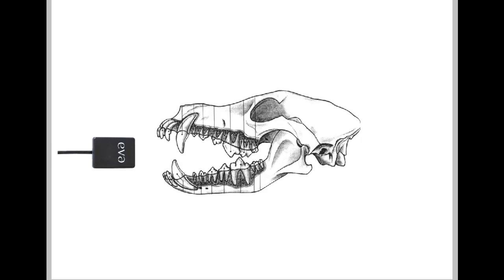And then again, going for the maxillary, we would face it in portrait with the image side up if we're going for the upper teeth, or the image side facing down, as you see here, for going for the lower incisors, which would be here, or for the lower canine.